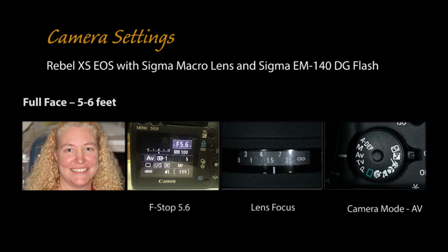In order to take this picture, you're going to need a good quality camera. You're going to need to understand the f-stop. You're going to need to understand how you function with the lens setting and what mode the camera should be under. And roughly to take this picture, you're going to be about 5 to 6 feet away. Now, a little more extensive training. This doesn't take long, but we do need to work with the office on the camera and how to function this. And that would be another great element that we're going to add into our DC Academy in future videos of actually how to function with these cameras and how to take these pictures. So you can look forward to that.